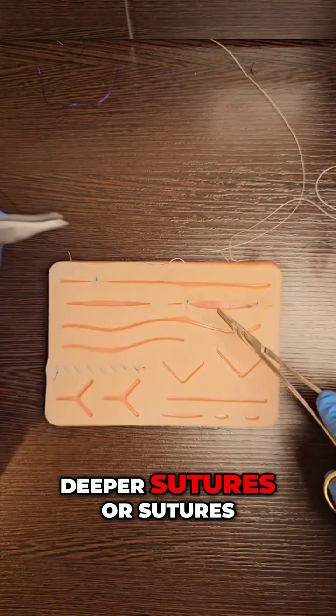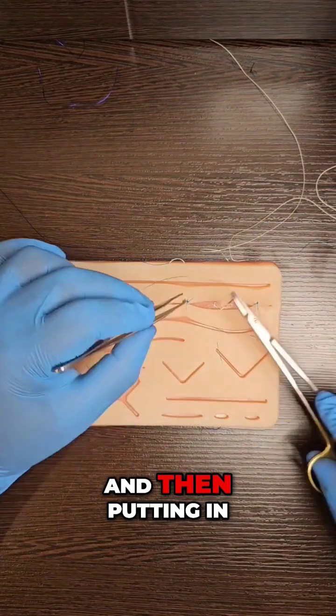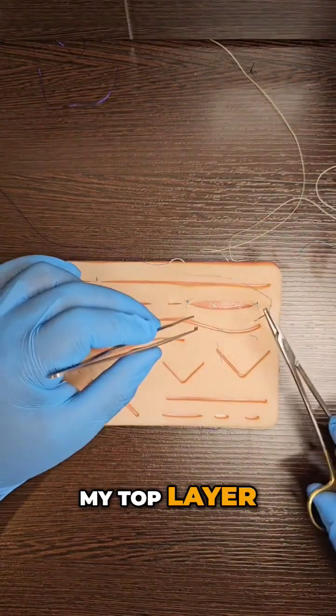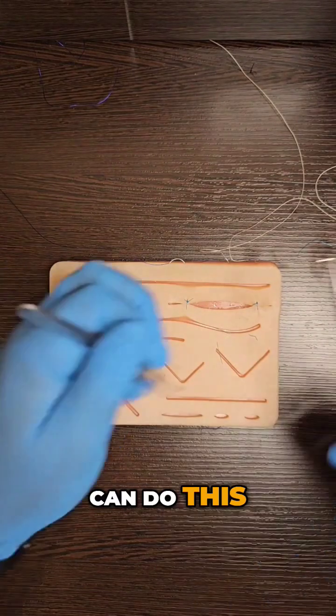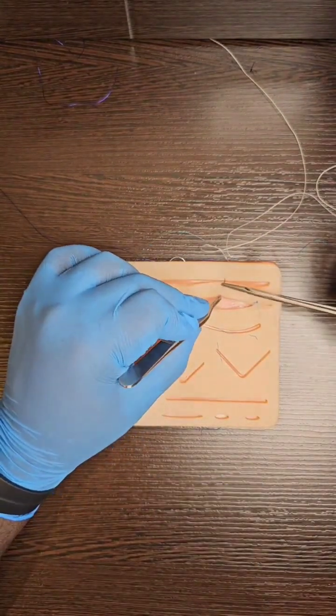Sutures on top that will take off the tension and then putting in my top layer. So there are two ways in which I can do this. The first way is to just take a big suture like this.